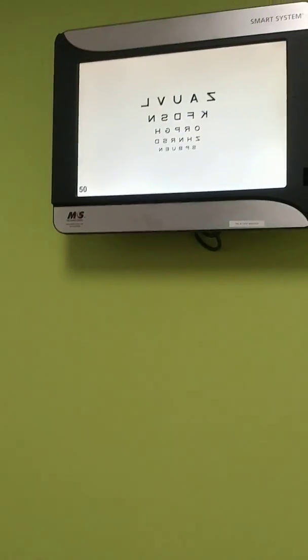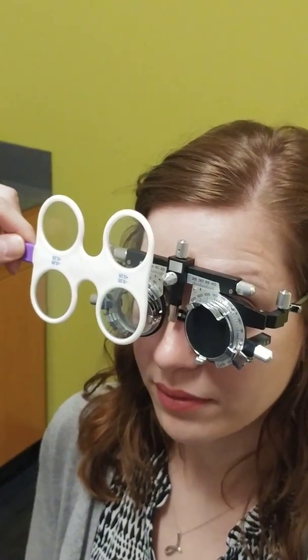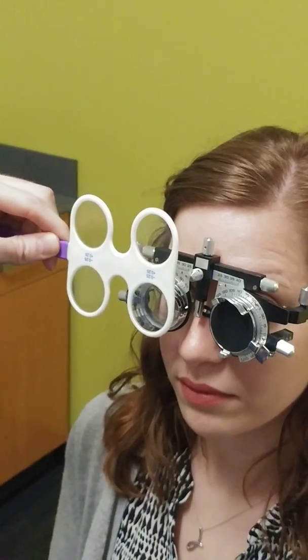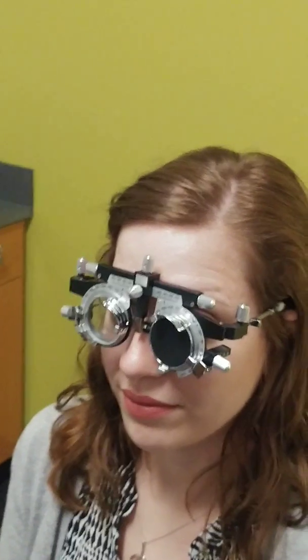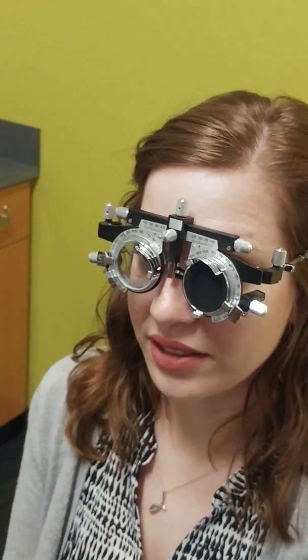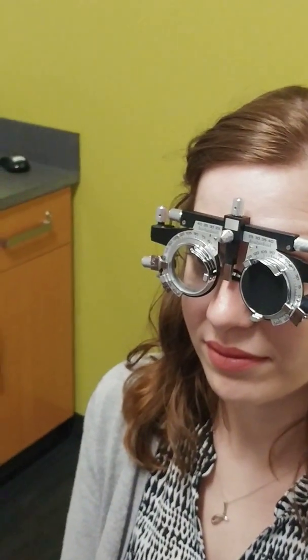She can actually read 20/20 because she's not really a low vision patient. So looking out here, I check which is more clear with one or with two — I now have a total change of half a diopter. If she says about the same, I know she might be over-minused. If she says it's the same with a quarter diopter more versus a quarter less, she's probably a little over-minused. You do one line above their best corrected vision for this check.